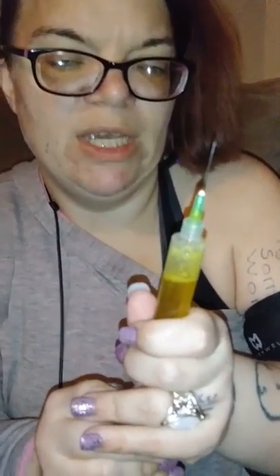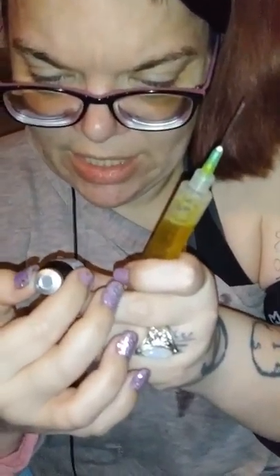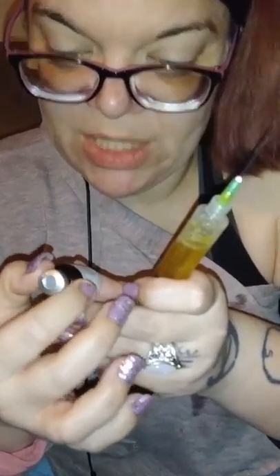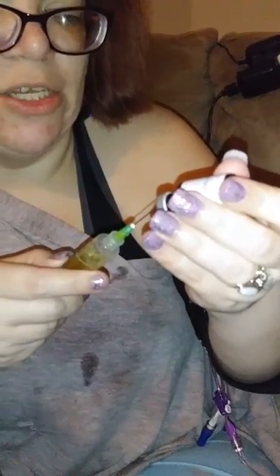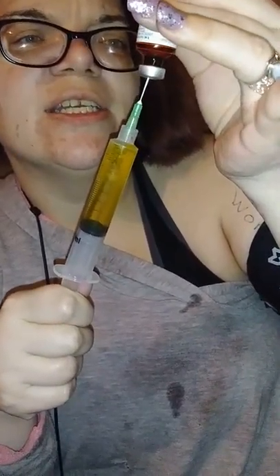Alright, so this is vitamin number two. Again, pop the top off, fill my syringe with some air. This one has the folic acid and biotin and B12. I mix them in the syringe because I know that my total needs to be a full syringe, and this way I know that I got everything in here in the correct amount.